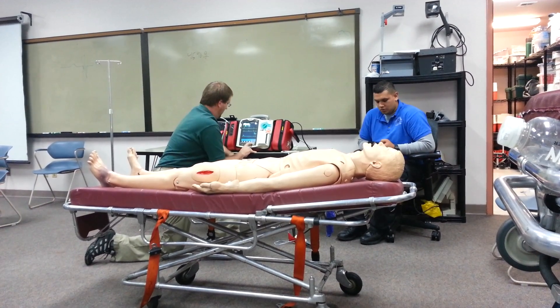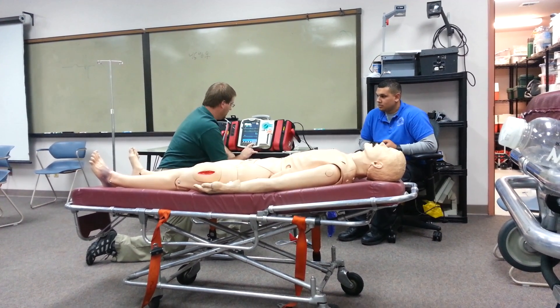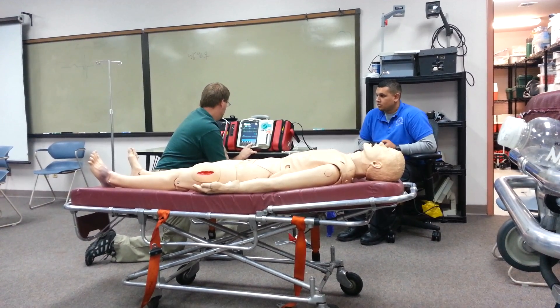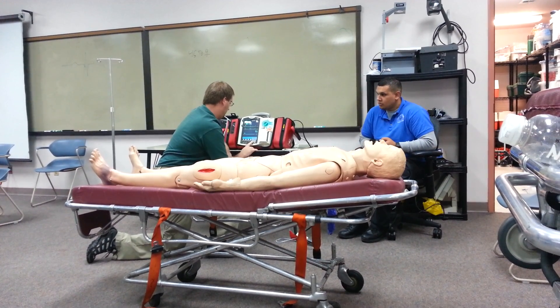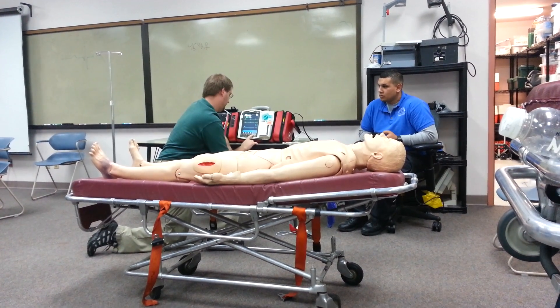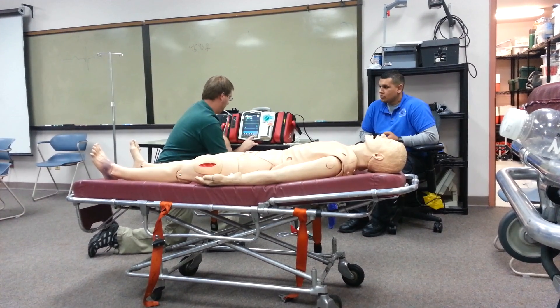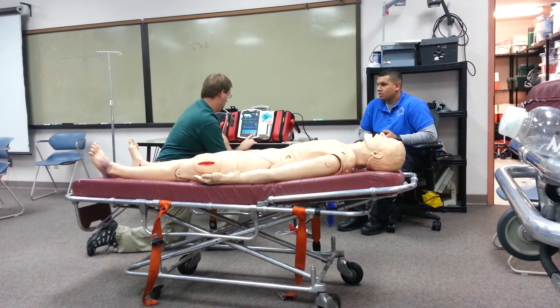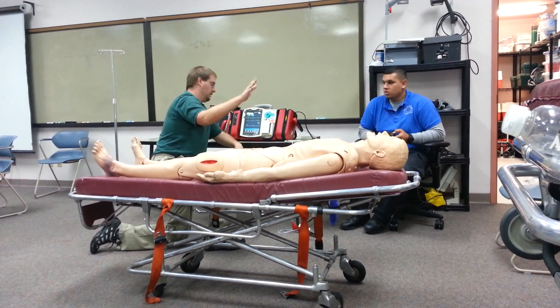Atropine is in. No response. I'm starting at 30 milliamps output and increasing, looking for electrical capture — 45, 50, 55, 60, 65, 70, 75, 80, 85, 90. I have electrical capture. Continue bagging the patient if there are no spontaneous breaths. Do we have a pulse? Yes, there is a pulse.